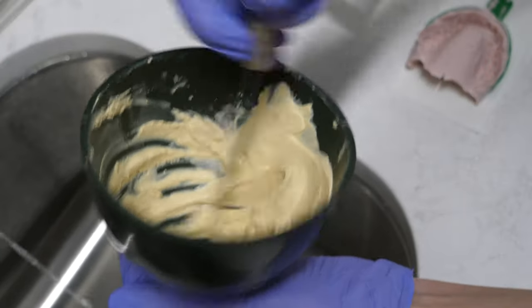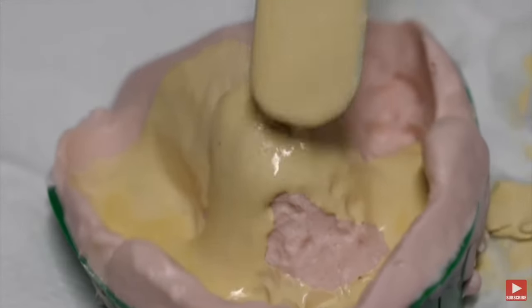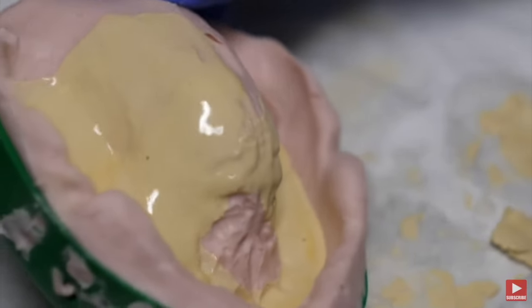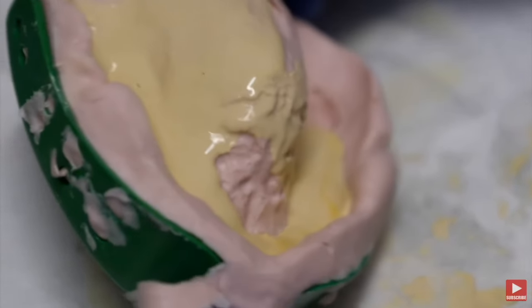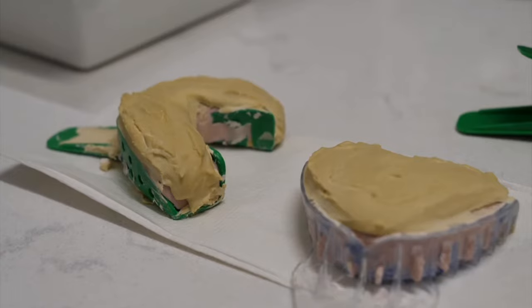We make a mixture with stone and water. The impression is then held on the dental agitator, which helps the stone spread throughout the impression and flow the mix into a mold. After the base is made, they allow it to sit and cool off.